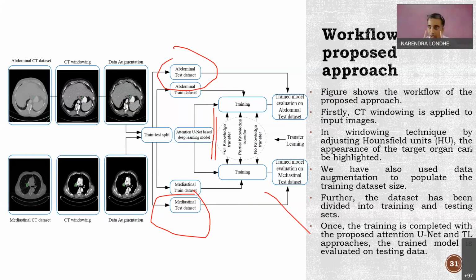If you go to the radiologists, Philips, or the imaging companies, the equipment provided by those companies comes with their software, and radiologists are able to trace anything on that. They can do manual tracing on it. If you capture their traced images and convert them into JPG, you can use them as a ground truth. That is the first option.